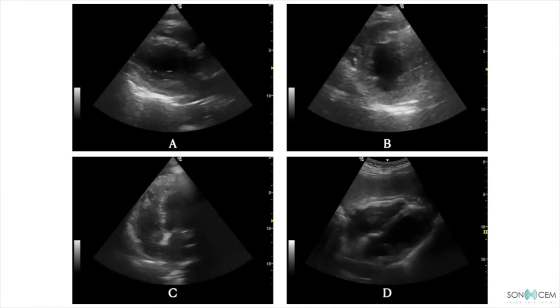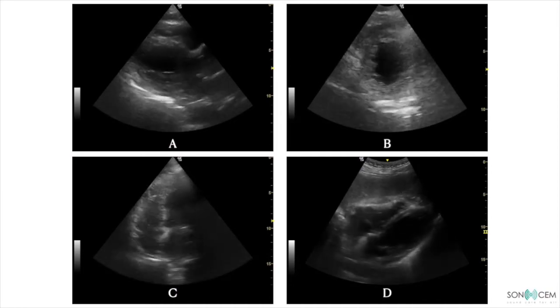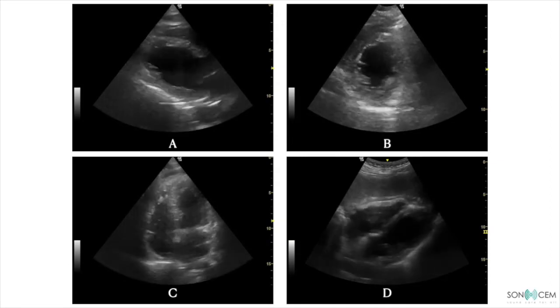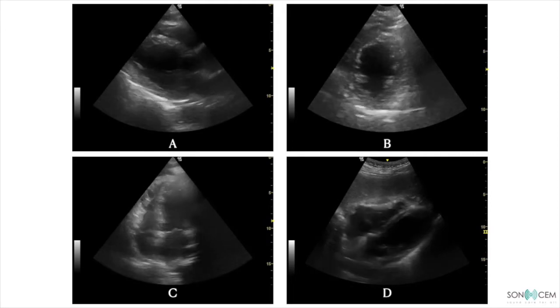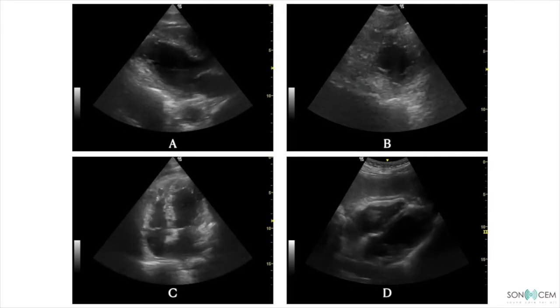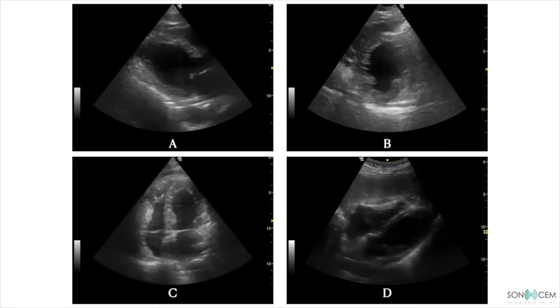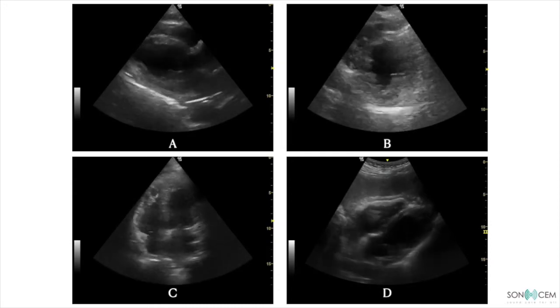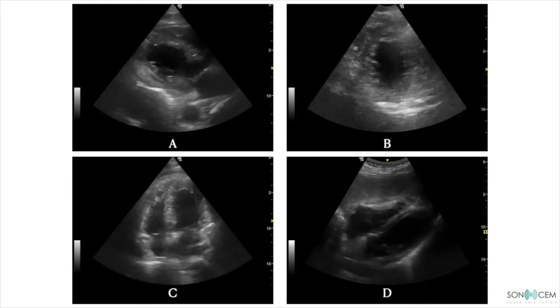So what is the role of point-of-care ultrasound here? Clearly, this patient has cardiogenic shock secondary to acute anterior STEMI. We can actually evaluate the regional wall motion and look at the complications of STEMI, such as ventricular free wall rupture, papillary muscle rupture, formation of thrombus, and more. However, these are not covered in this basic PoCUS series.